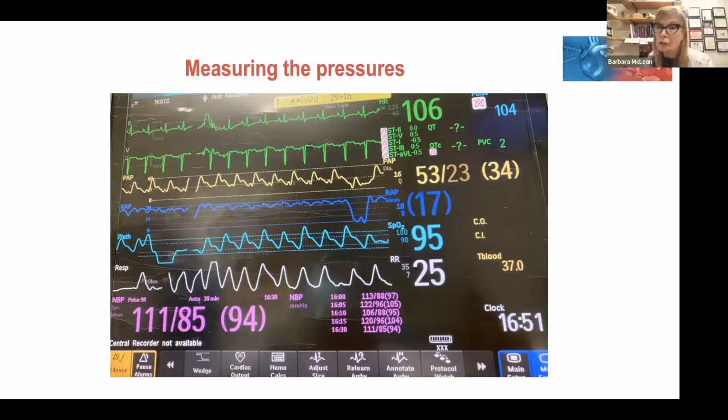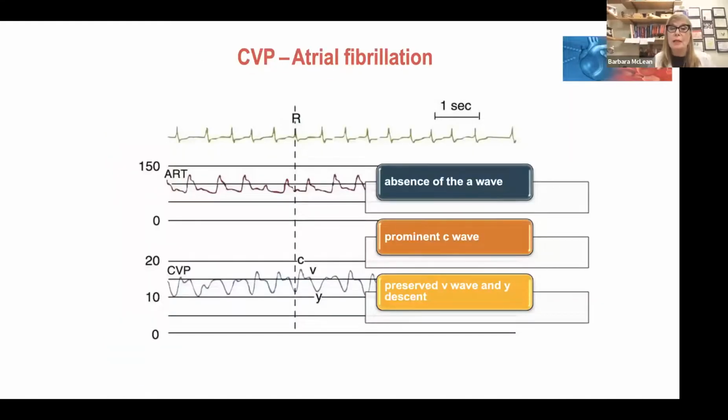Your patient needs nitric oxide. Your patient needs pulmonary dilation. You can't allow your patient to sit like this. There's something really wrong here, because this is not about volume. This is about compliance. You could really make a difference in how patients do under your care if you are focusing on evaluating waveforms and having a better idea about what's happening.